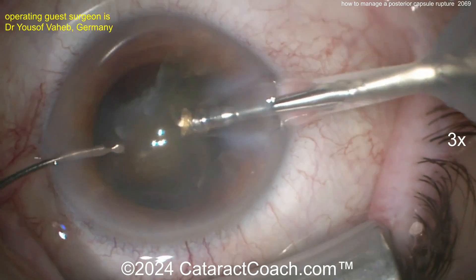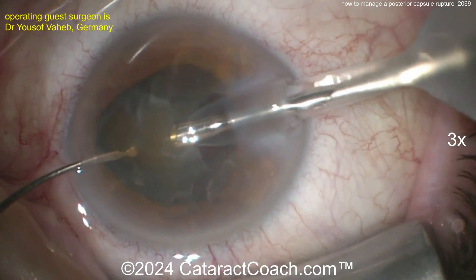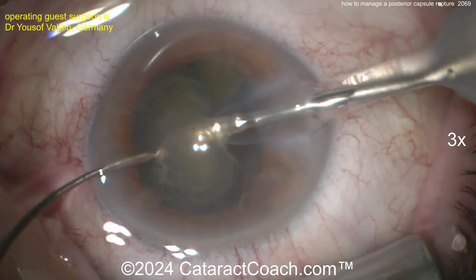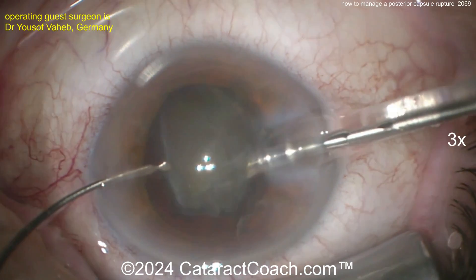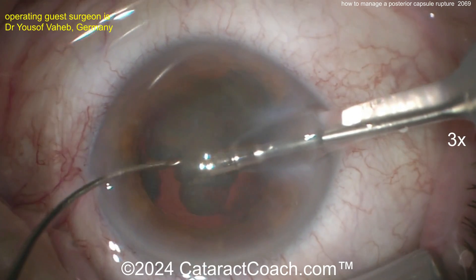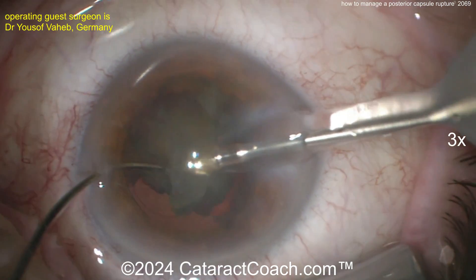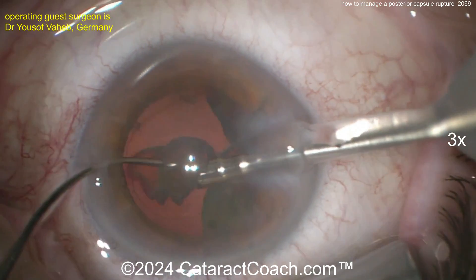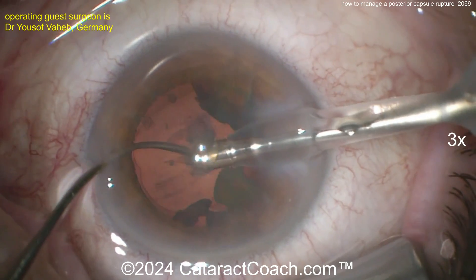We've sped the video up a little bit. Let's see if we can figure out when the capsule breaks — we already know that's going to happen. Removing this nuclear piece, there's a little bit of chamber instability. You can see a little bounce in the anterior chamber — see the iris moving? That's not good, because that means you're more likely to nail that posterior capsule as it flops up.